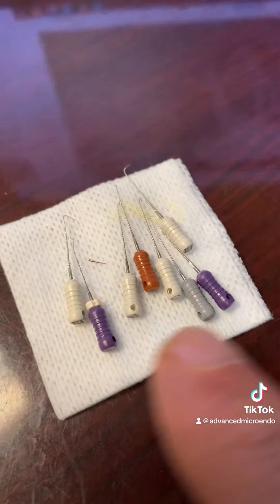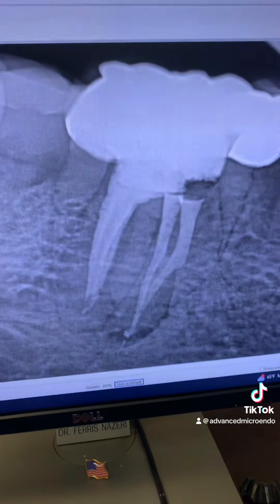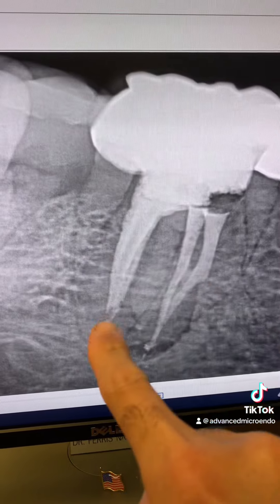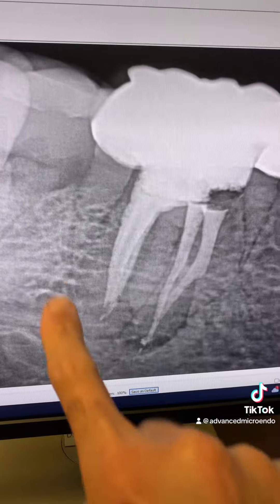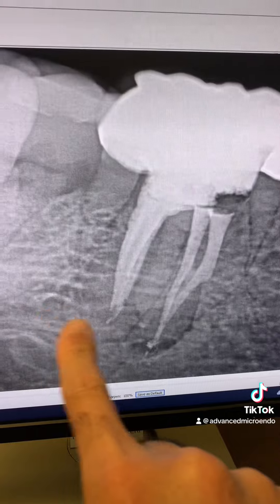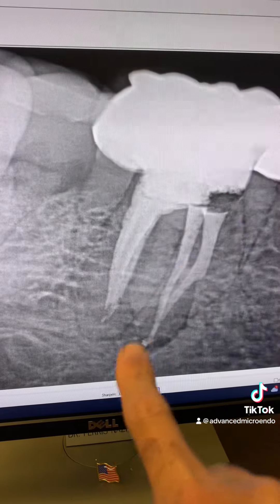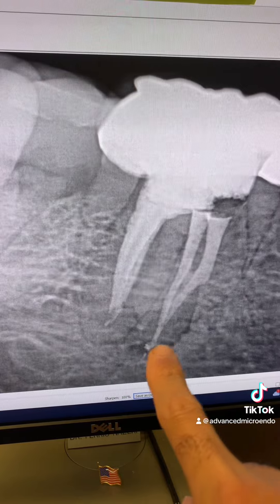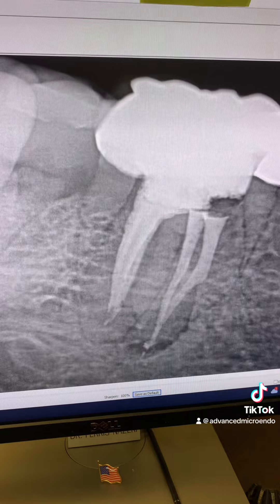You can see how many files I destroyed to be able to regain patency. The distal canal — I was not able to regain patency. I tried my best but couldn't do it. But there are no periapical lucencies there, so I'm not overly concerned. The periapical lucency and infection are associated with the mesial buccal canal. I was able to regain patency and instrument, clean, and disinfect the apical region of that canal.